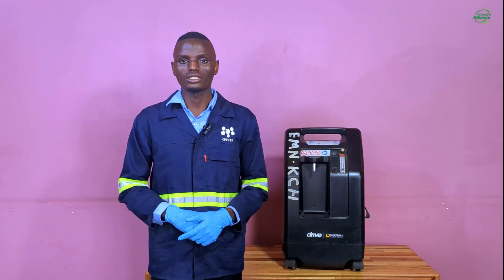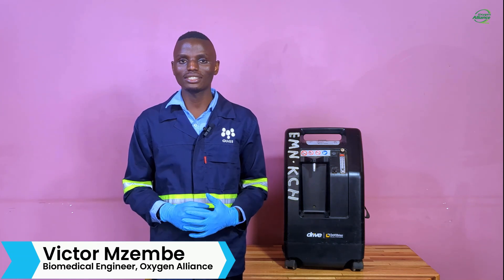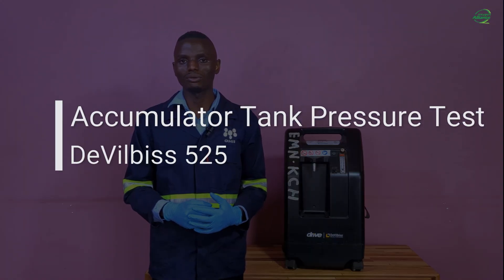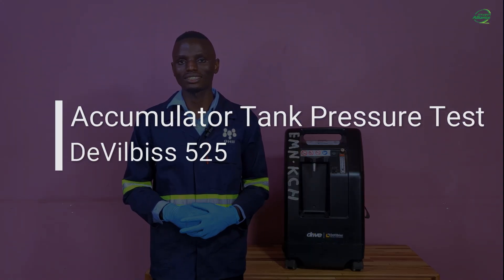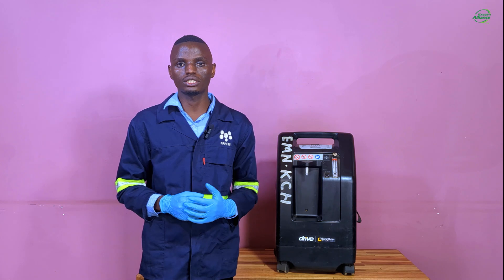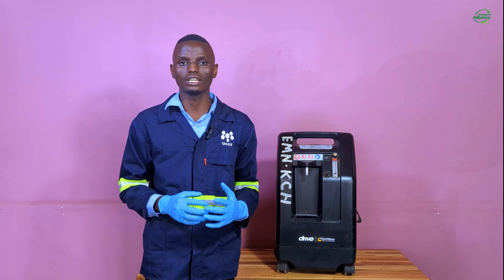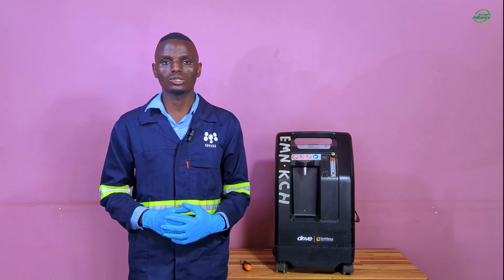Hello and welcome to the Oxygen Alliance YouTube channel. My name is Victor Nzembe, I am a biomedical engineer at Oxygen Alliance. Today I'm going to make a demonstration on how to perform the accumulator tank pressure test on a Devilbiss 525 oxygen concentrator. The accumulator tank, also known as the product tank, holds the concentrated oxygen produced by the concentrator, and from this tank it is released through a pressure regulator and a flow meter to the patient output port.